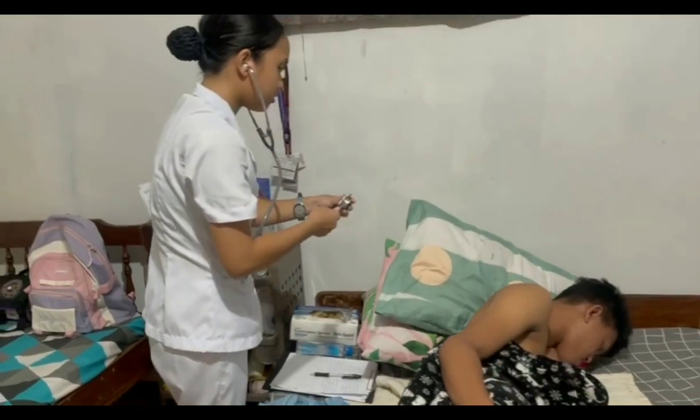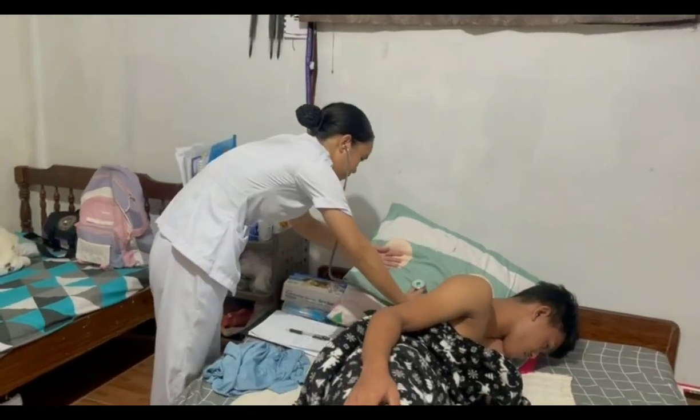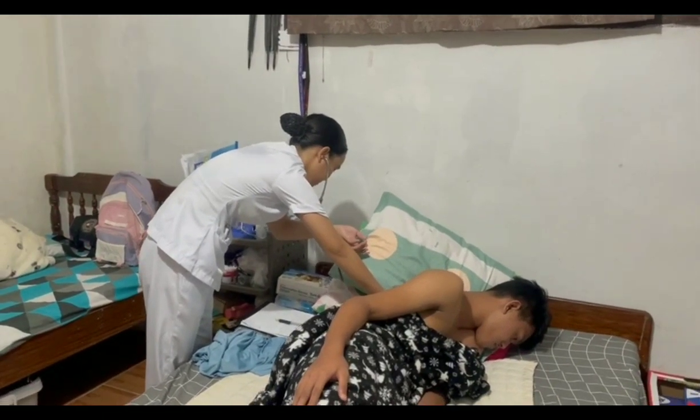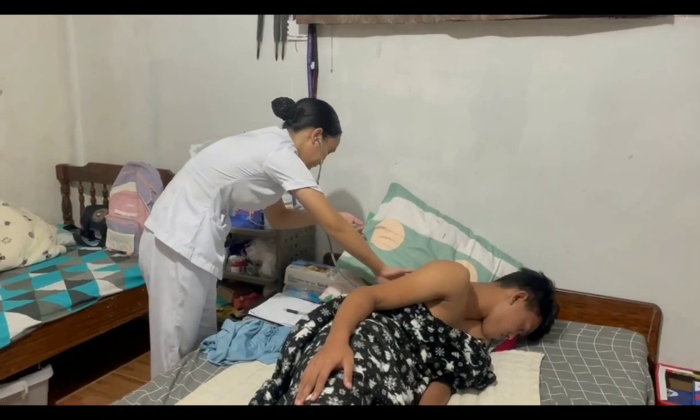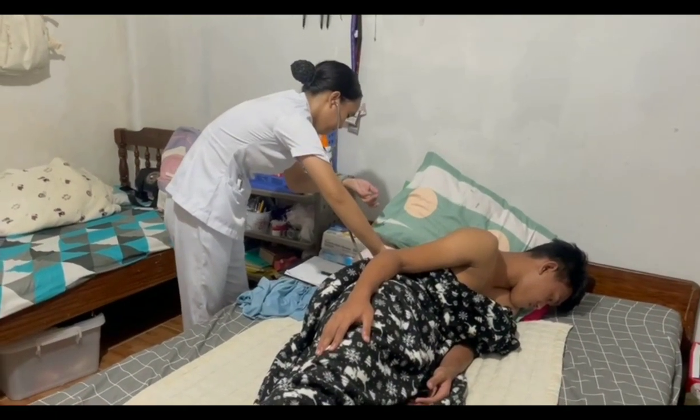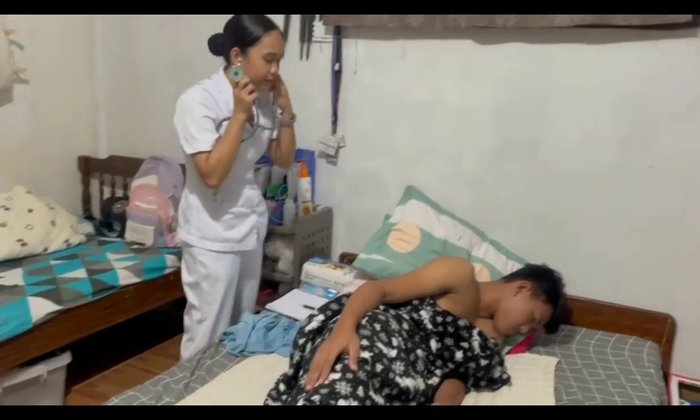And now I'm gonna use the bell. Okay, sir.